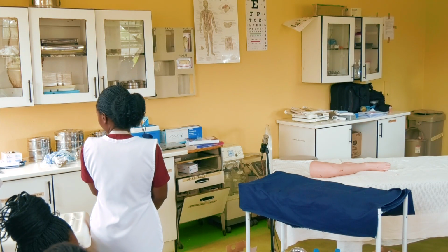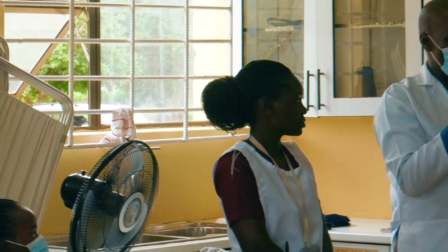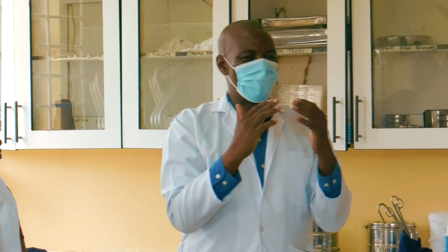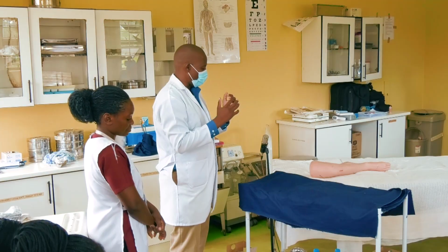So scrubbing, done. I've scrubbed. The way I will be moving now, I will not drop my hands. I will be moving like this. Again, my hands are not supposed to be above my head, but just between my waist and somewhere by the neck area. So I will be moving like this. I've scrubbed. Supposed to wear something short-sleeved.